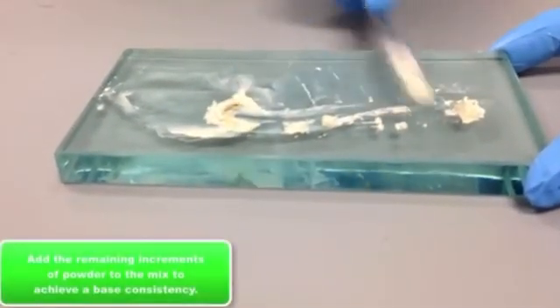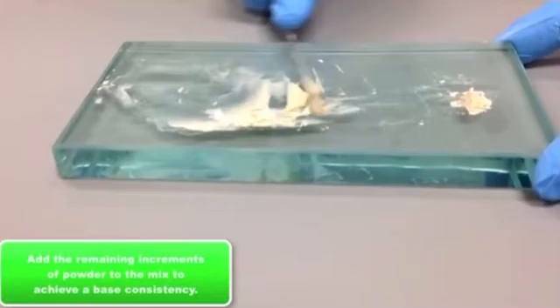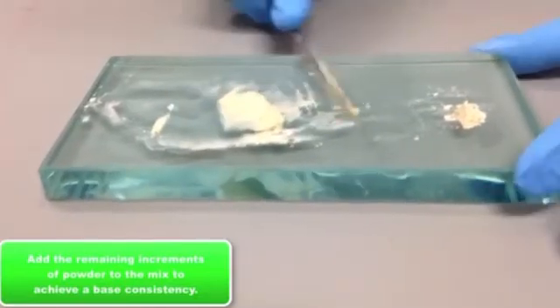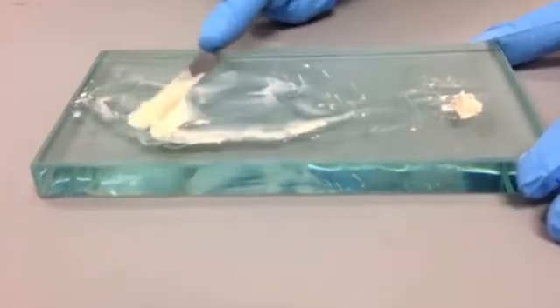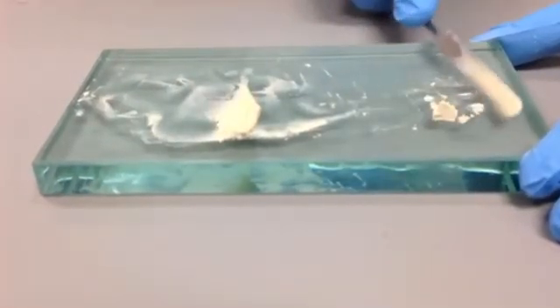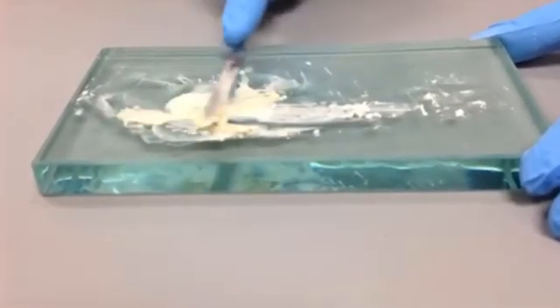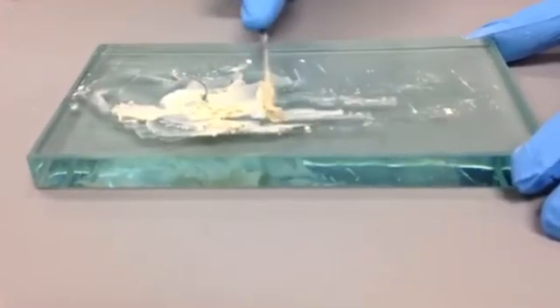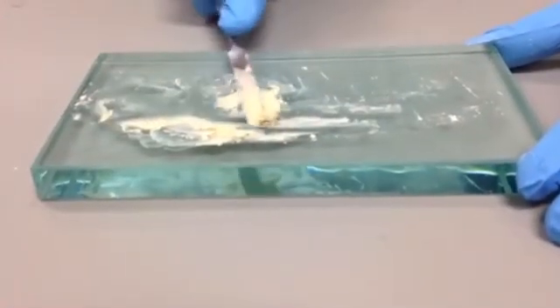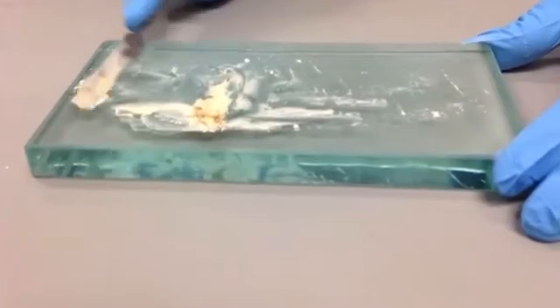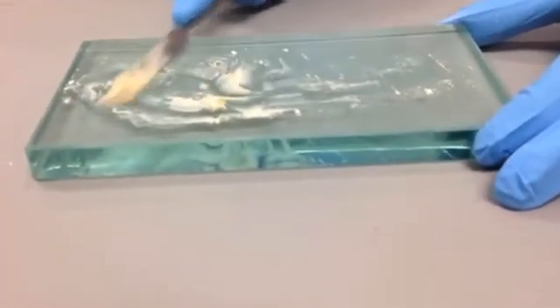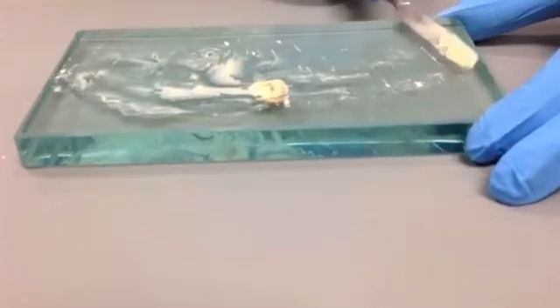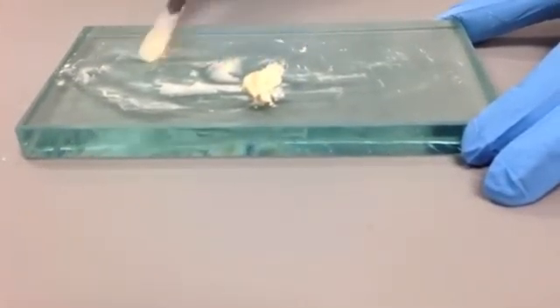And now she will continue to add powder to get it into a more stiff base-like material. And ideally, once you get to that consistency, you will be able to actually roll it into a ball or sometimes it's nice to roll it into a cigar shape if you're putting it into a temporary or restorative situation where you want to cut off pieces of the cigar shape.